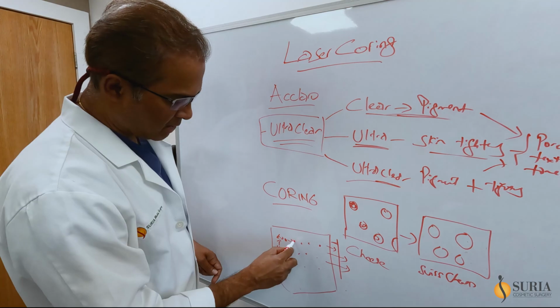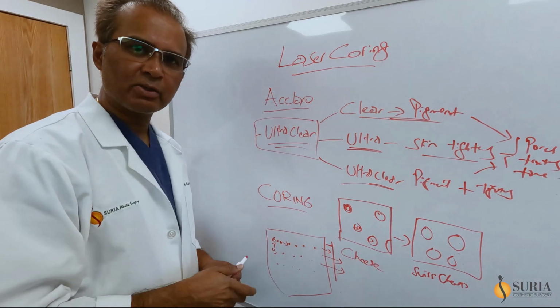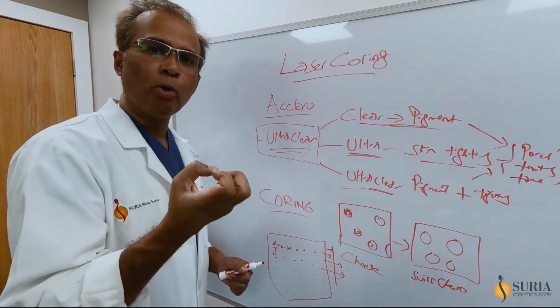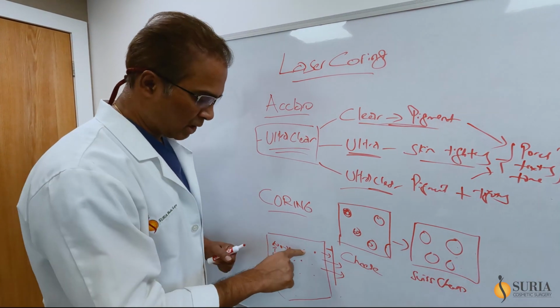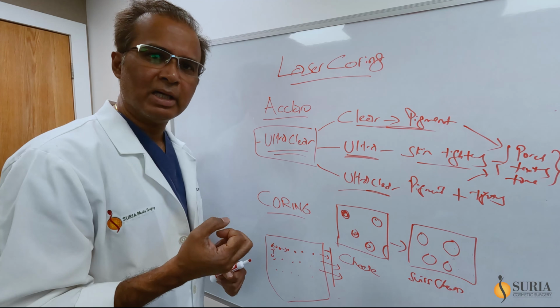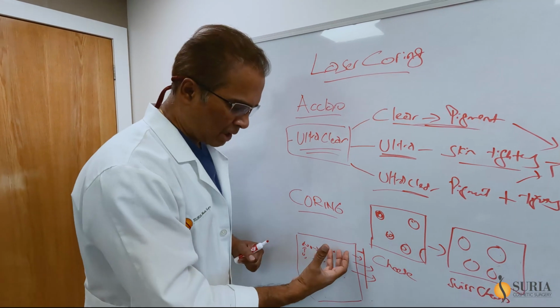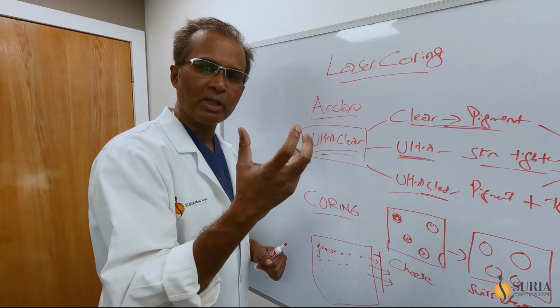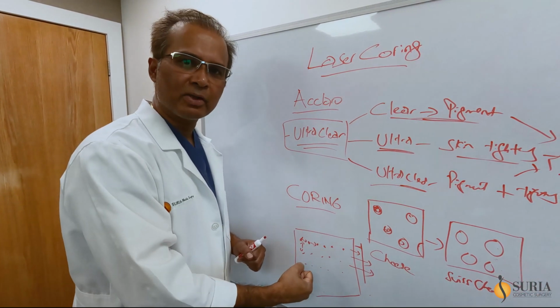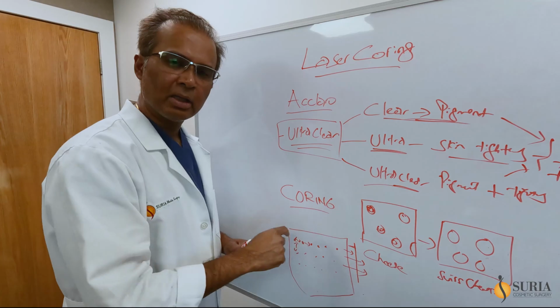So essentially you vaporize these microscopic holes on the surface of the skin that penetrate down deep, what we call full thickness of the skin. So you're essentially removing that skin or vaporizing it, almost like cutting out the cheese. And when you have that, you have a hole in the skin, basically, that amount of surface area, although it's microscopic. Now if you combine all of this spaced out so that it heals properly, you've reduced the amount of skin there is. And therefore, the concept and the theory and the expectation is that it's going to rejuvenate by contracting when it closes off. Almost like when you have a wound and you close it off. Similarly, this is going to close off and cause tightening of the skin, full thickness tightening of the skin. So if you do a broad area and you do it with coring, that's what's going to happen.